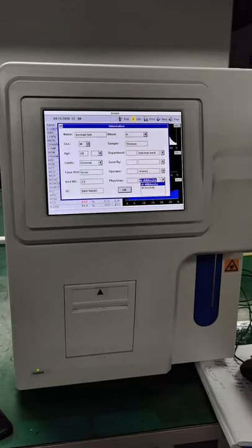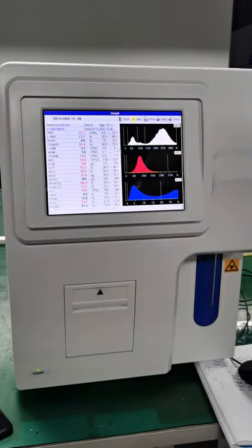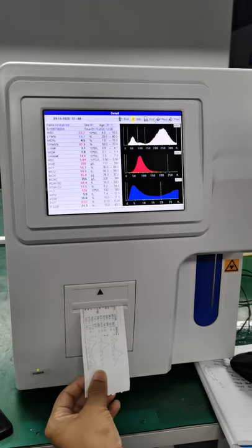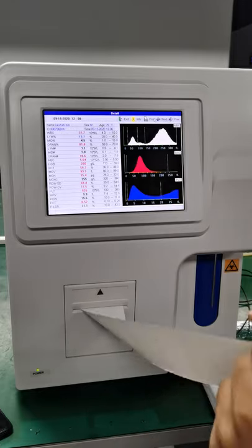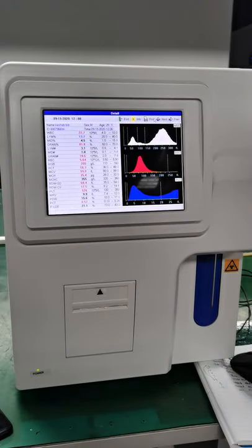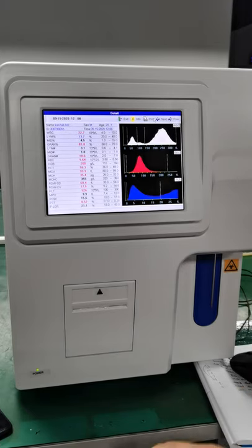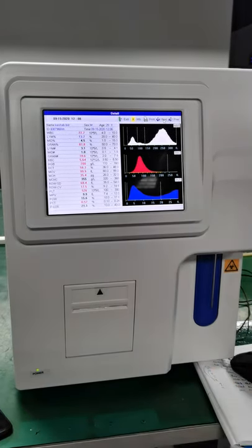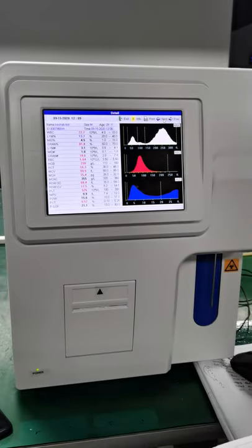And physician, you can add Dr. Keshav. And maybe you can just change a little bit. Okay, so you can just change like this, okay? And then you can print it. So, this is the result. Okay? So the information about the patient, we can first input the information and then load the sample and get the result. Or we can load the sample and get the result, and then we can add the information about the patient. Both ways are okay.